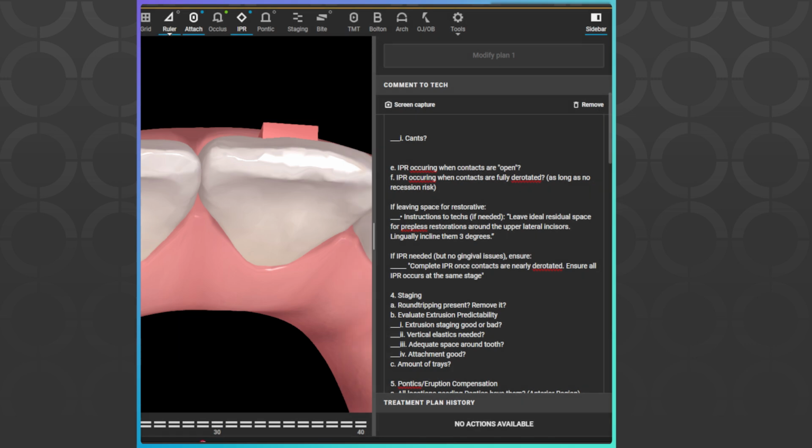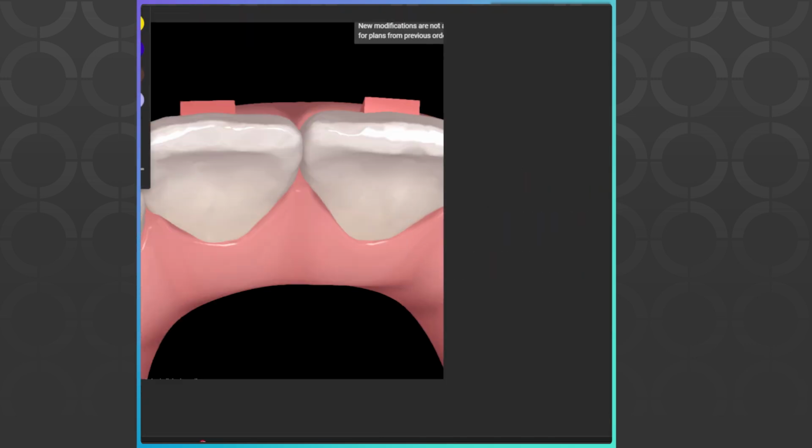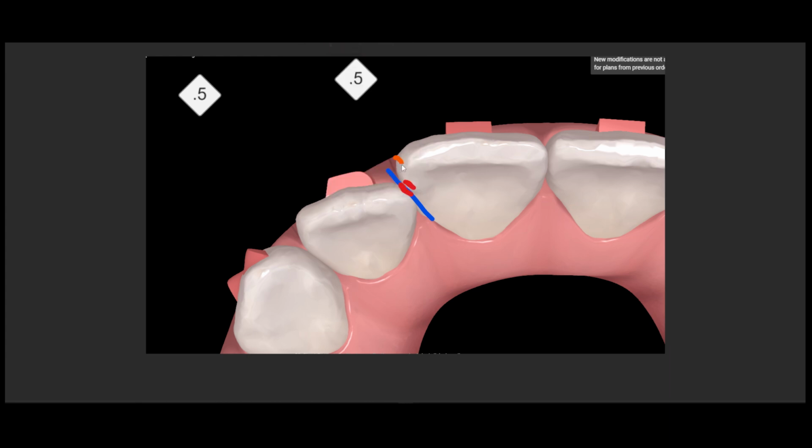So let me show you. If you're doing IPR right now, where it's going to occur, you're kind of coming in from this angle or maybe this angle here, but either way, you're doing more off of the buccal surface of the tooth right here, and more off of the lingual surface here, whereas the actual area that you want to be doing the IPR to reduce the mesial distal width is right here and right here. So you're not doing the interproximal reduction on the right surfaces to actually decrease the width of those teeth.